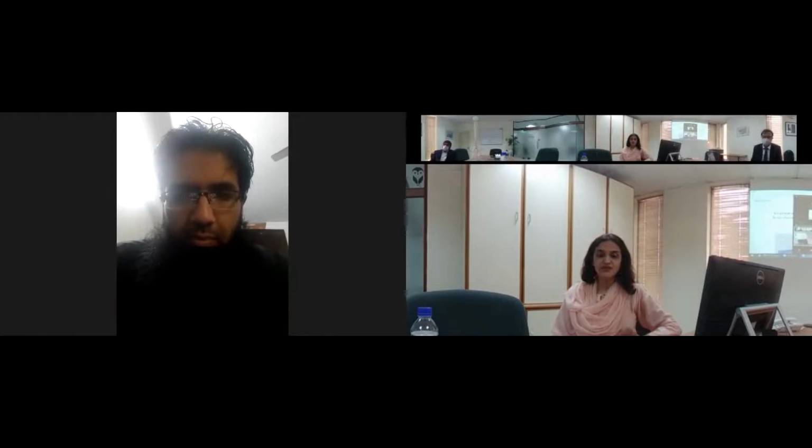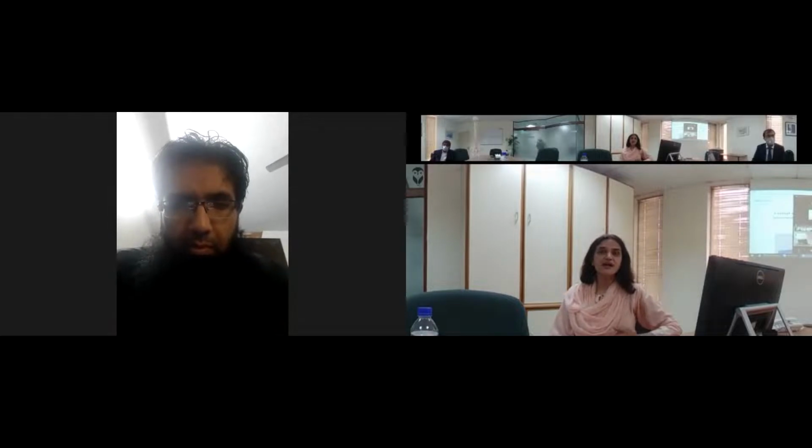Pratik, if I may ask you, regarding celiac plexus neurolysis, the video that you did over here demonstrated a 2-needle retrocrural approach. Are there any other ways of doing the celiac plexus neurolysis?